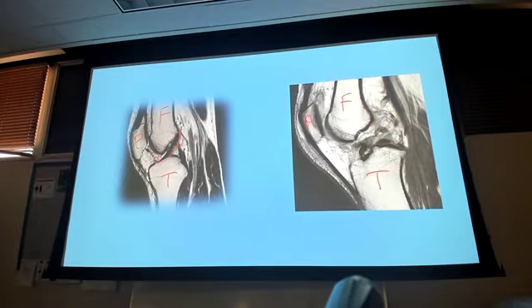On top of that, look at the gap in the joint space. That's a factor too. But again, I'm not going to make you pull out a torn ACL on an MRI. I show that to you because when you learn your physical exam findings, there are special tests you can do where you're going to think, I think you have a torn ACL.